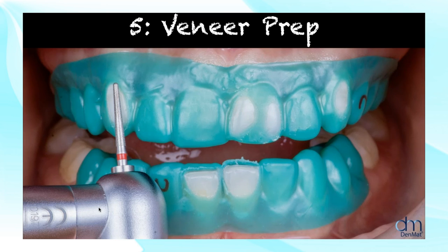We take a good photograph of this too, and it's really, really simple to prep all these veneers. The reason for that is because you have a guide. So there's really nothing we can mess up because the guide is there to lead us, to know exactly how much reduction we're going to need. And the patient's going to be happy. The lab is going to be happy. Everyone's going to be happy.